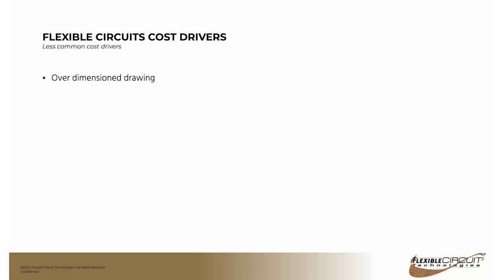An over-dimension drawing. I'd like to show you some that I've seen over the past, but due to confidentiality issues, we can't do that. But I've seen some things that are pretty crazy. Keep in mind that flexible circuits are flexible, and any dimension that you put on your drawing, we have to verify. And this is especially important on catheters because of the length.